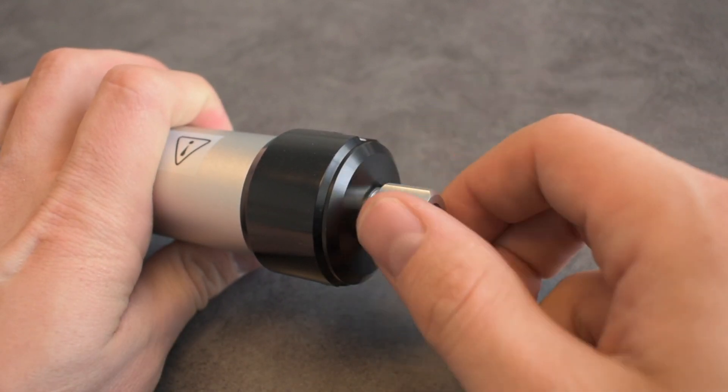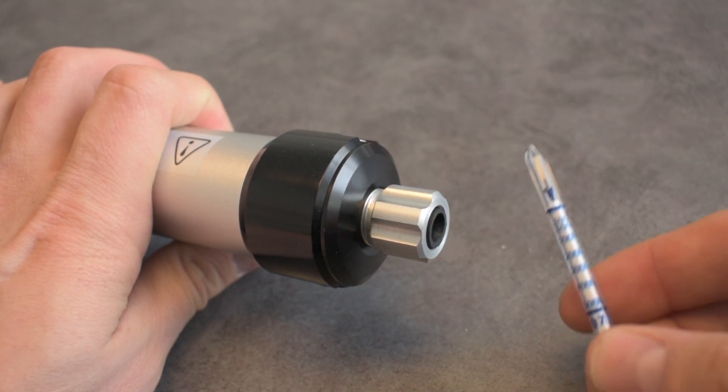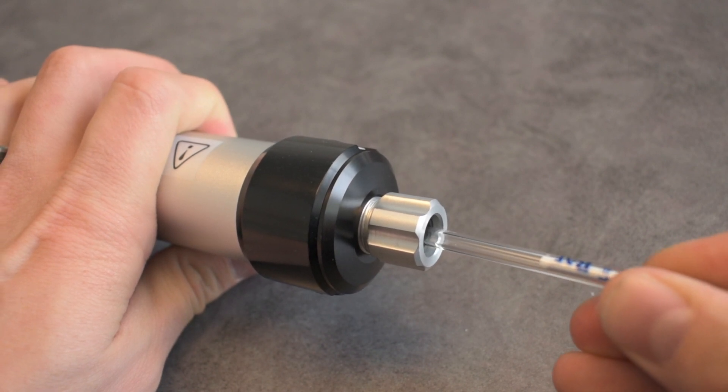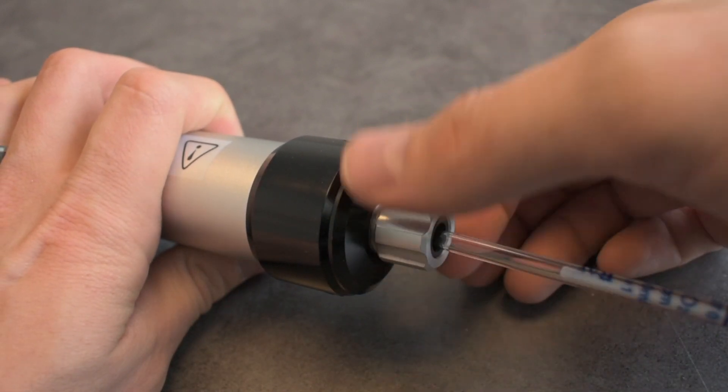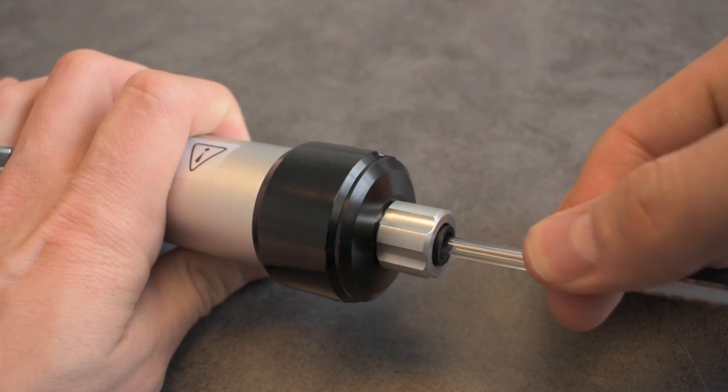Loosen off the pump inlet nut. Take note of the arrow on the tube to get the correct orientation. This arrow should point towards the pump inlet. Insert the tube until it bottoms out. Tighten the pump inlet nut until the tube is held securely in place.